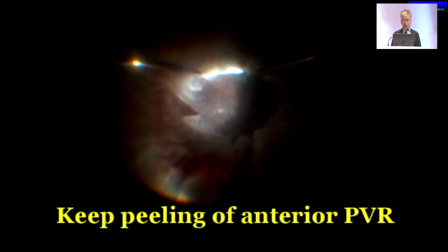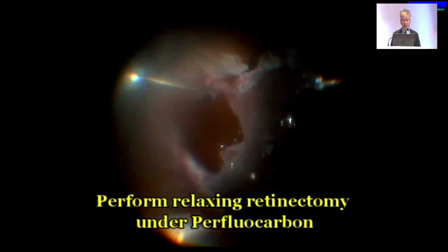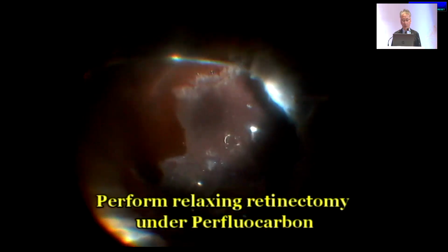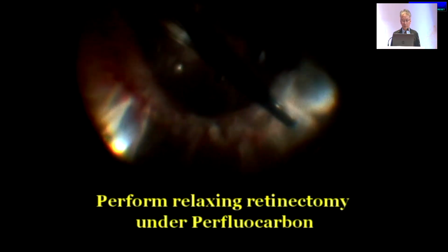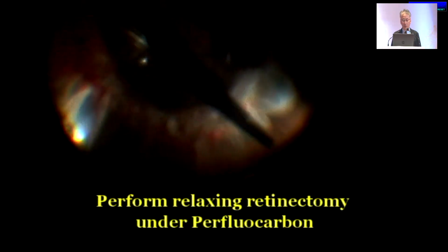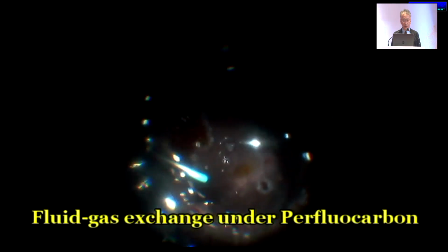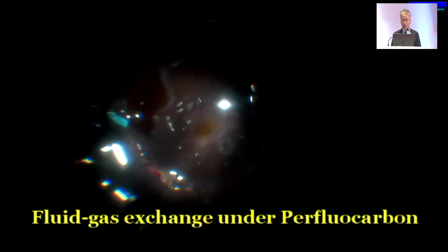And then I kept on working on the anterior PVR. Then I injected the perfluorocarbon, and continued to peel the membrane like this. And I placed a high buckle for this patient. Now I start to have the anterior PVR at the lower retinectomy. Then I use a fluid-air exchange under the perfluorocarbon. Also, oil exchange to avoid slippage of this retinal fold.